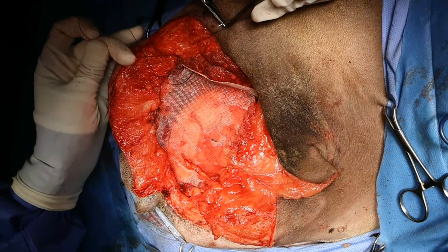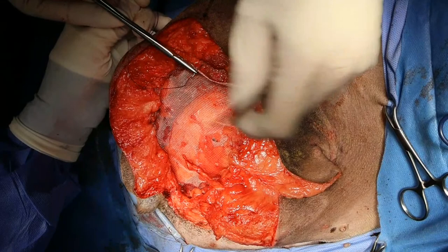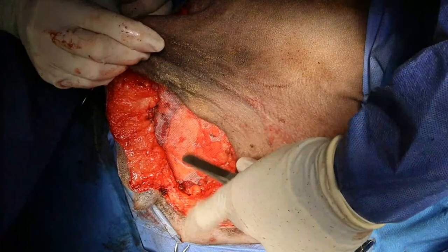All right, so I think I'm going to go ahead and wrap it up now. Basically, we're just going to do a sub-Q closure, and then we're going to take that big flank fold flap that we created at the beginning of the surgery and bring that across to close the defect. Sean, can you just pull that across to show how that's going to be plenty of skin? So we've got heaps of skin there to close that up, and I'm not going to put any kind of drain in here because that mesh communicates with the abdomen. The abdomen is great at resorbing fluid, so we've got plenty of room there.